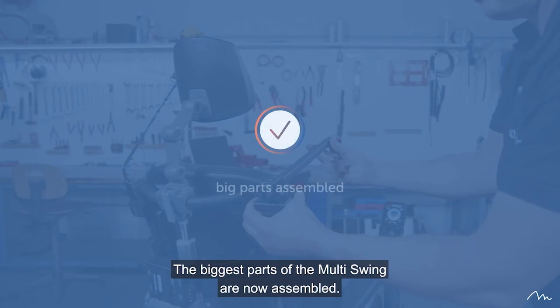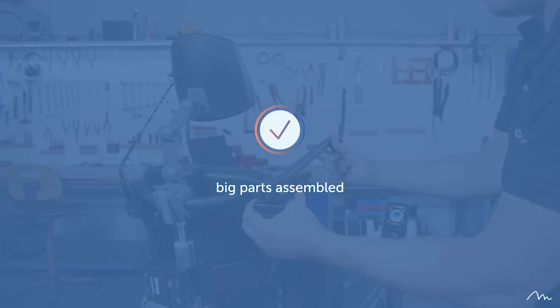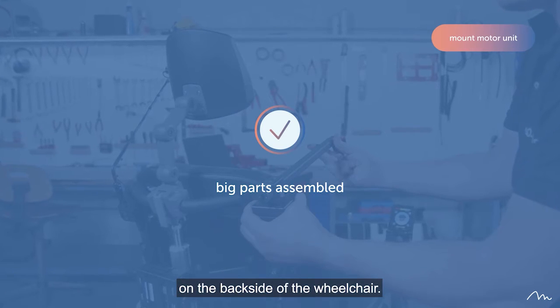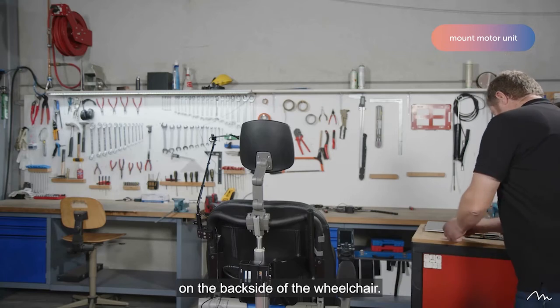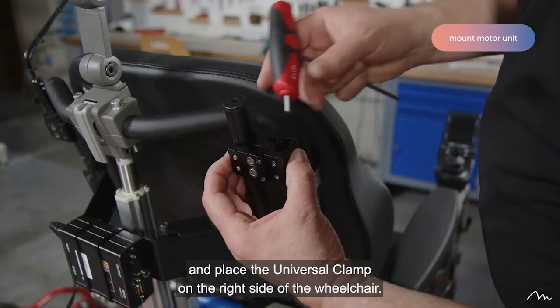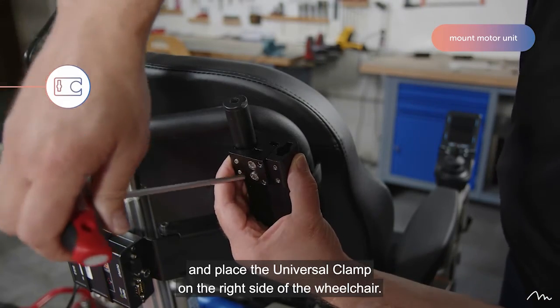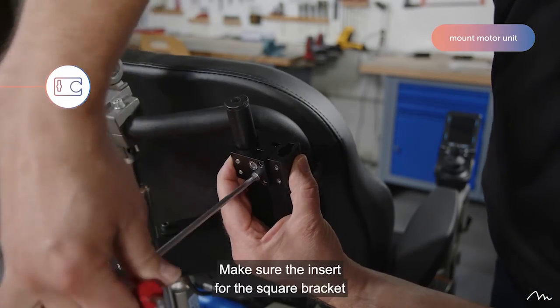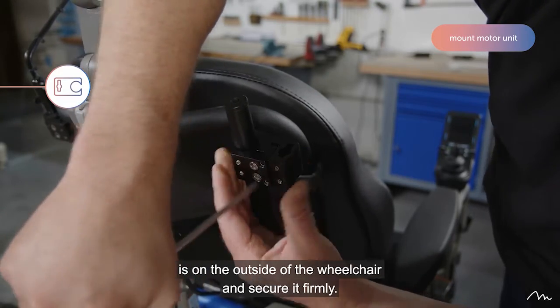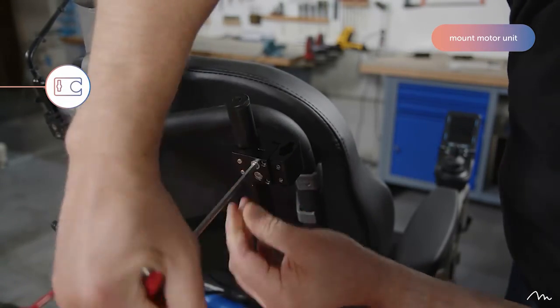The biggest parts of the multi-swing are now assembled. You can continue by mounting the motor unit on the back side of the wheelchair. Check if the wheelchair is in its normal position for the user and place the universal clamp on the right side of the wheelchair. Make sure the insert for the square bracket is on the outside of the wheelchair and secure it firmly.